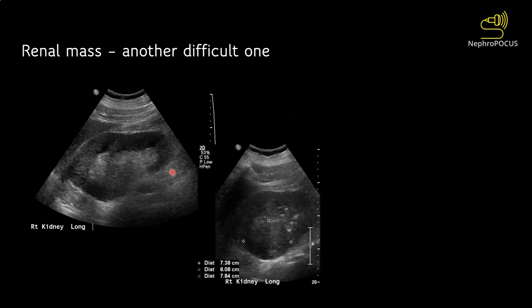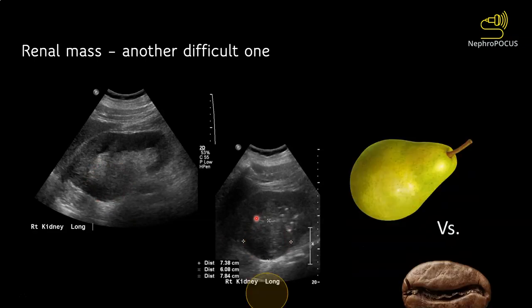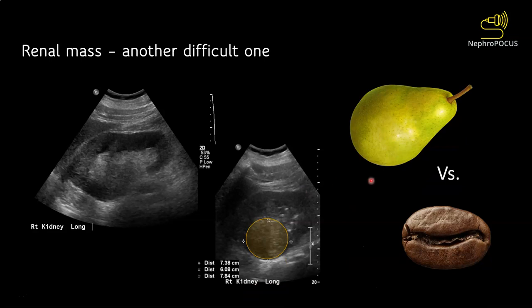Here is another example. This mass is near isoechoic to the surrounding kidney. The only way to diagnose this is by paying attention to the kidney outline — instead of being a regular bean-shaped organ, this kidney is more pear-shaped. That should make you suspicious. On close observation, a mass was found which is pretty isoechoic. So pay attention to the outline of the kidney.